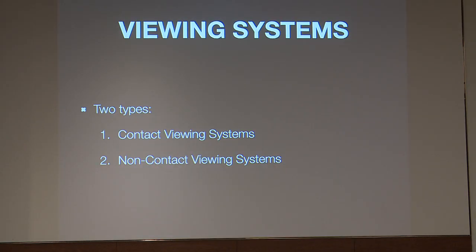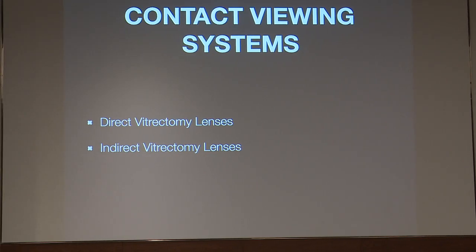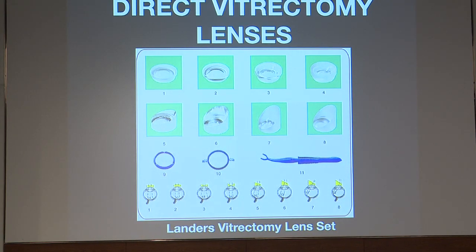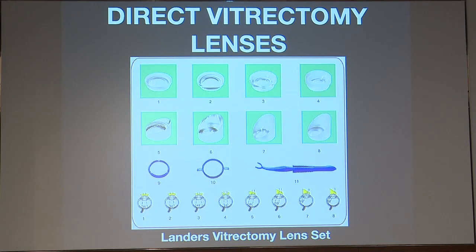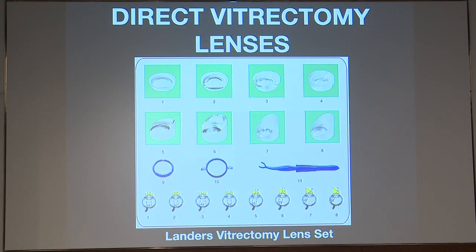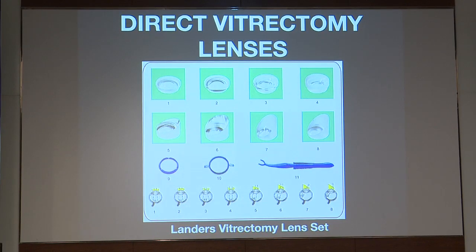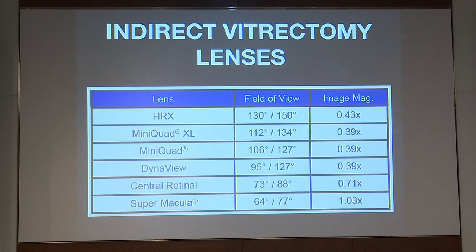Coming to the viewing systems. Viewing systems are basically two types. They can be either a contact viewing system or a non-contact viewing system. In contact viewing systems, further, there are direct vitrectomy lenses and indirect vitrectomy lenses. Direct vitrectomy lenses form an erect image, and they come with a combination of prisms and flat lenses along with a ring, which is called the Landers vitrectomy system. You have to suture the rings, or even there are non-suturable rings available now, and you have to use different rings to see different parts of the retina. It's quite a cumbersome procedure working with this. I've seen this happening, but personally I'm not a big fan of it.